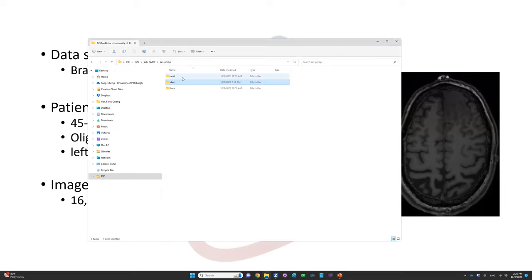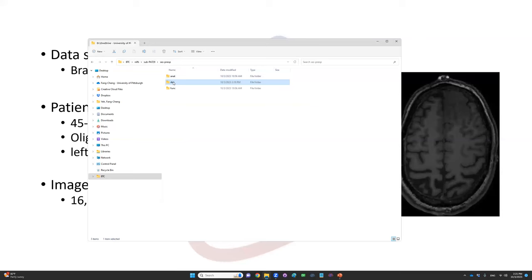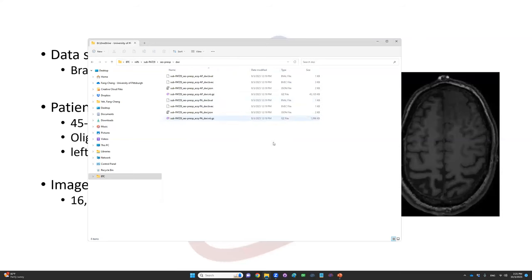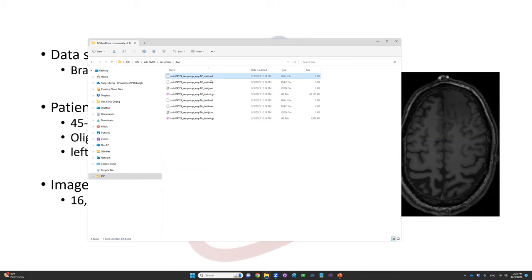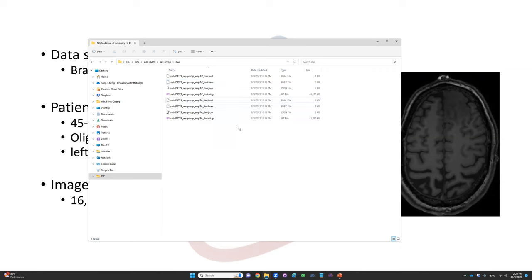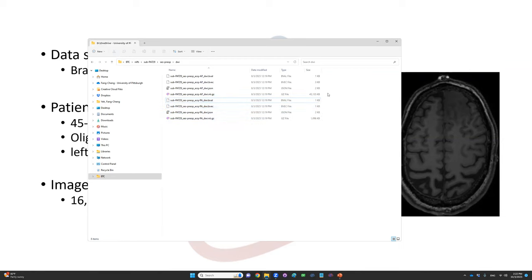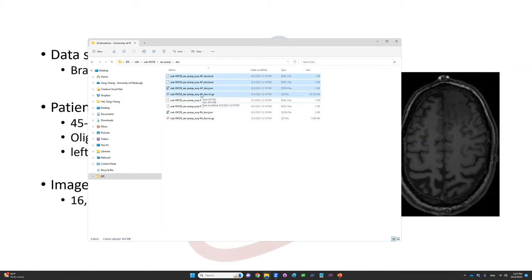If you download the data from the Open Neuro website, the data will be stored in different folders. The one under DWI are the data we're going to analyze. The format is NIFTI format with .nii.gz. The B table is stored as .bval and .bvec. You'll see there's another set of data called PA data, which is different phase encoding data for correcting phase distortion. But today we're only going to use the anterior to posterior phase encoding direction.